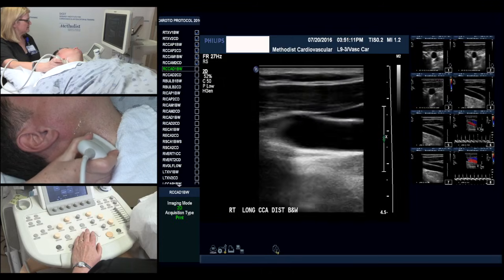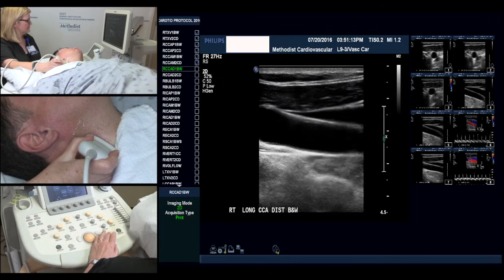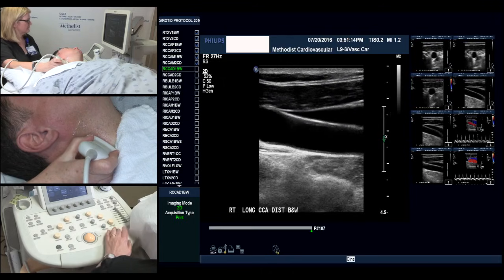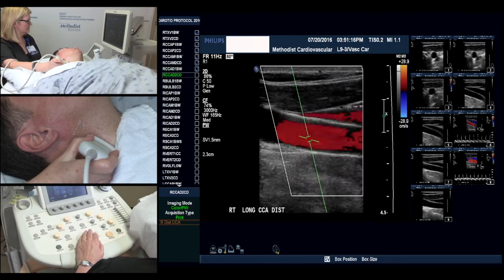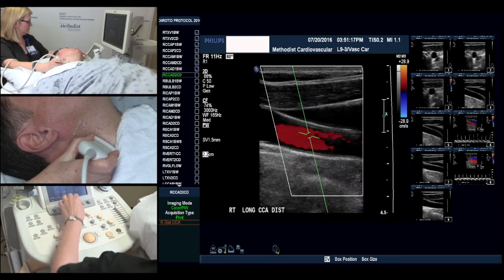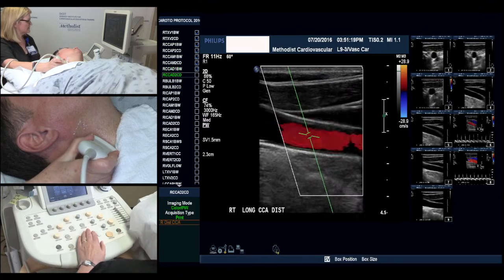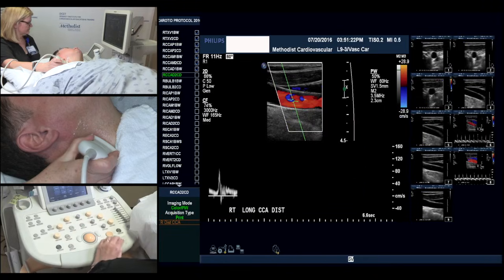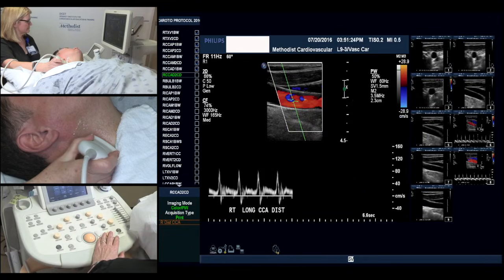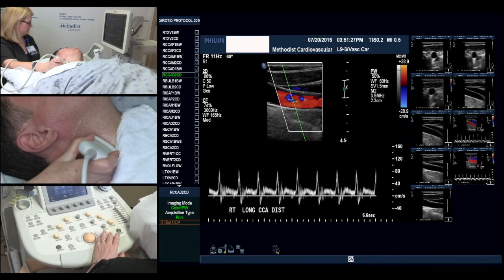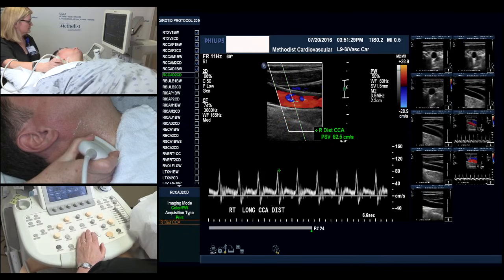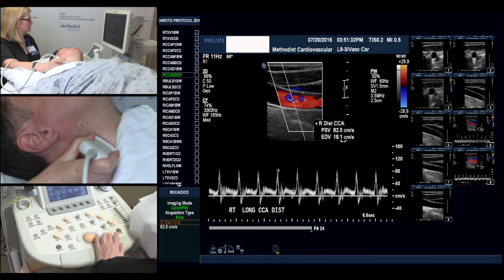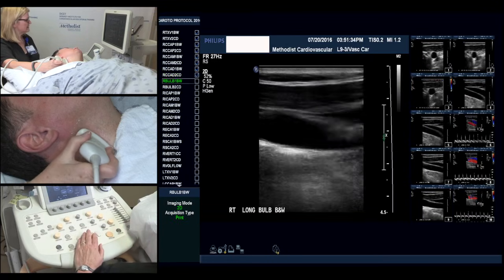And now we move into our distal common carotid. We'll adjust our steering angle, and again, measuring our velocities.